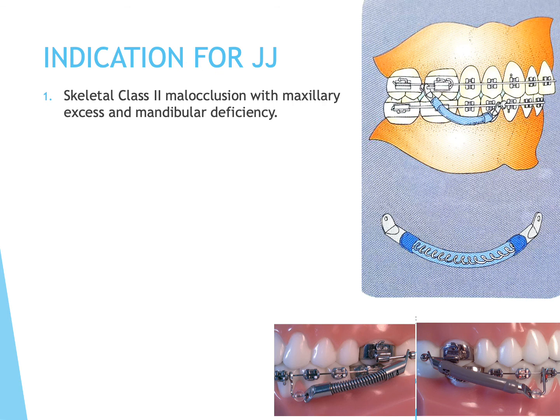Indication for the Jasper jumper. They are basically indicated for skeletal class 2 malocclusion with maxillary excess and mandibular deficiency.